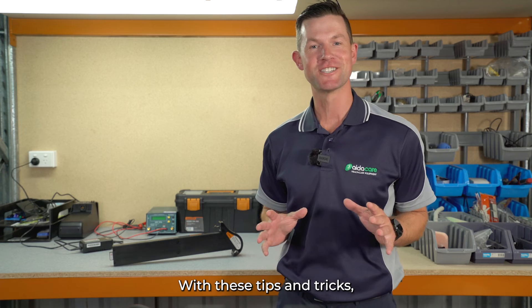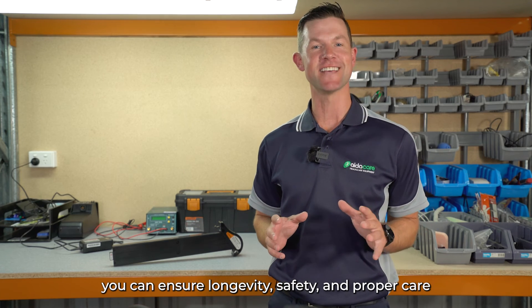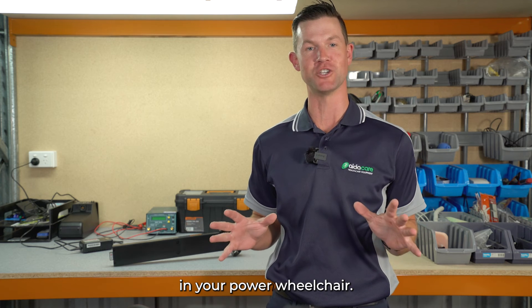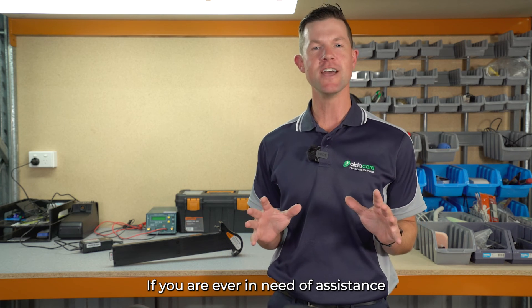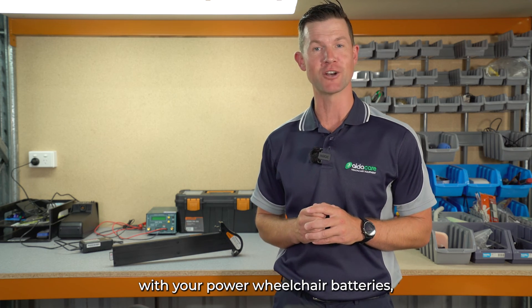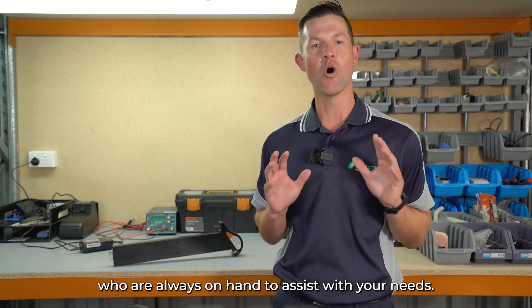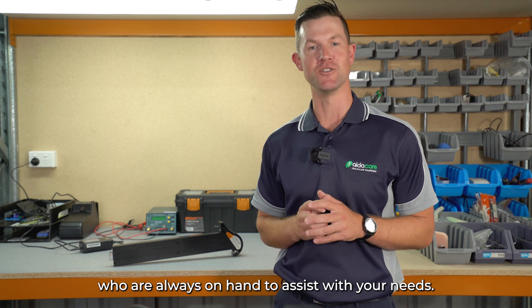With these tips and tricks, you can ensure the longevity, safety, and proper care of the lithium-ion batteries in your power wheelchair. If you're ever in need of assistance with your power wheelchair batteries, reach out to your local AidaCare service technicians, who are always on hand to assist with your needs.